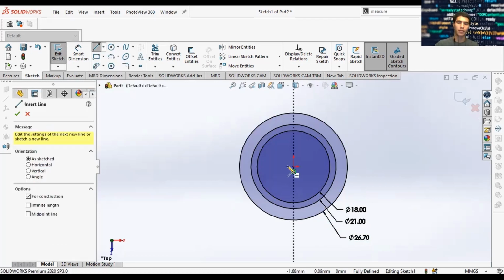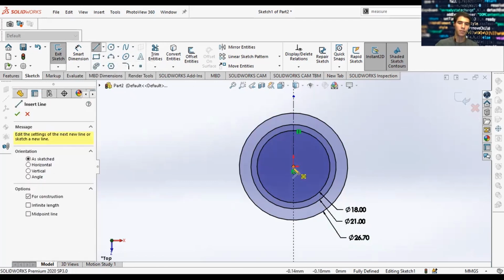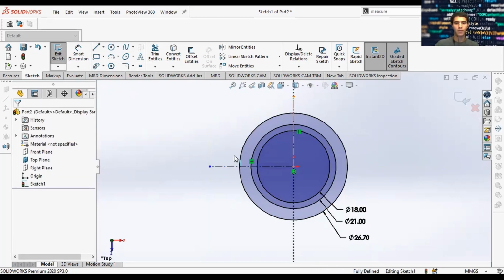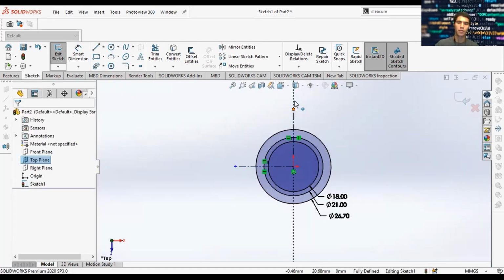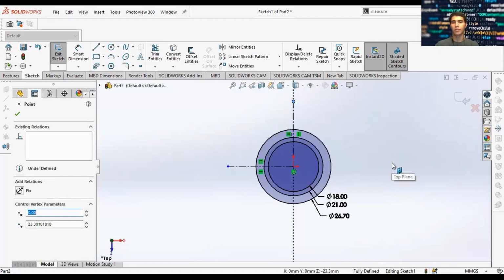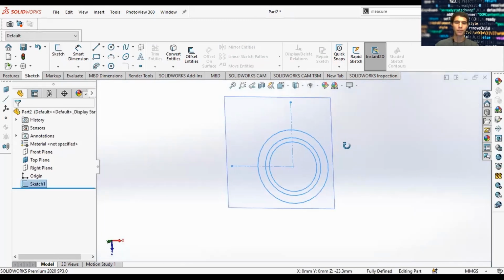Let's go ahead and put some reference geometry and set these equal to each other. So we'll set them here equal on the parameters. We're going to add a relationship. So now these two lines are equal. And then once we're good, we just press D on our keyboard and we approve the sketch. Now this sketch is approved.